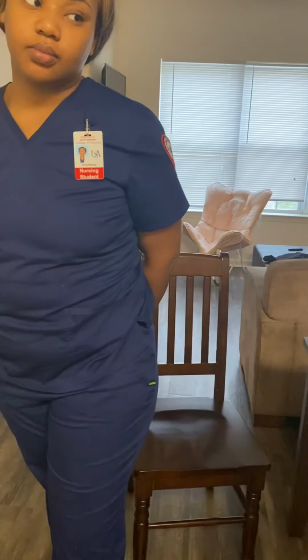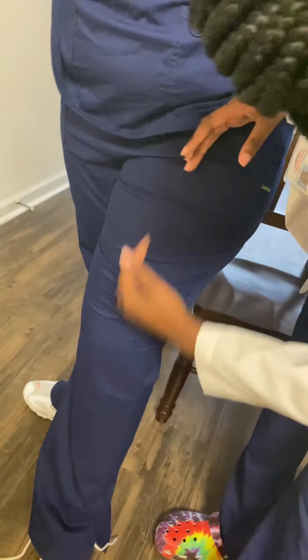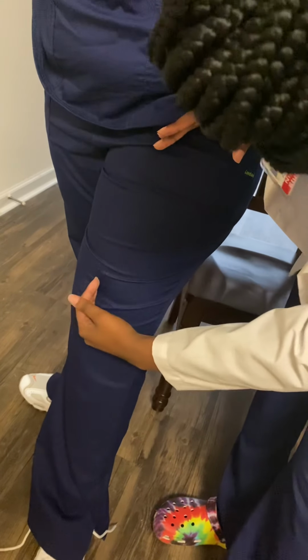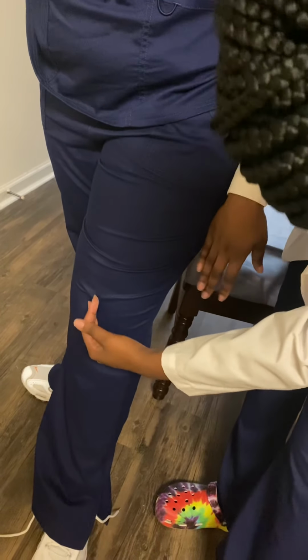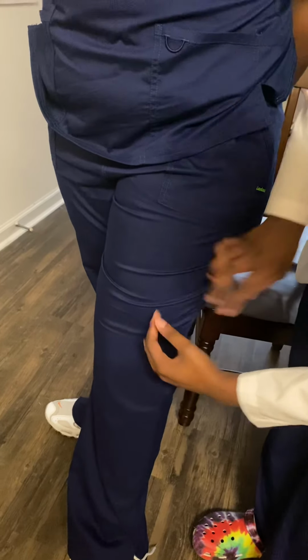And for an intramuscular, I could do the vastus lateralis, and for that I would locate the greater trochanter and the knee, and it would be in between this area. I'm going to go down the midline of the anterior portion and the midline of the lateral portion. So right in this little area is where it would go.